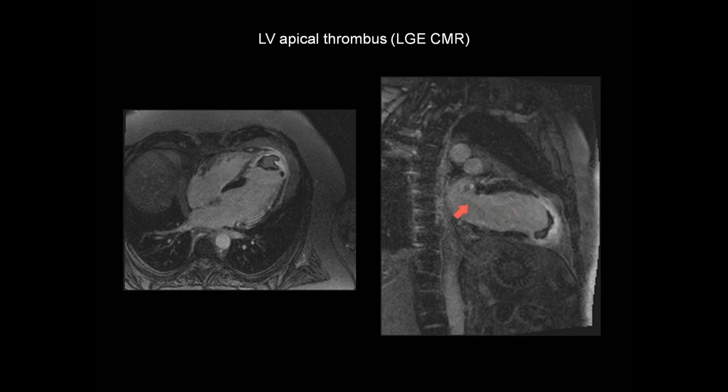This is a two-chamber view — left ventricle and left atrium. And again, there is late gadolinium enhancement, virtually full thickness throughout much of the apex.